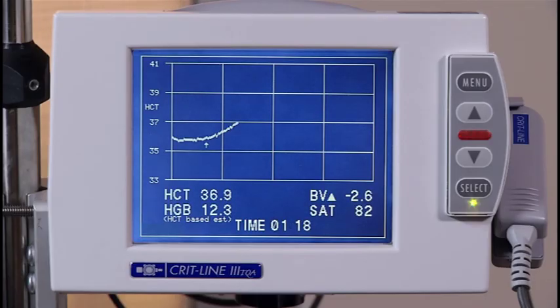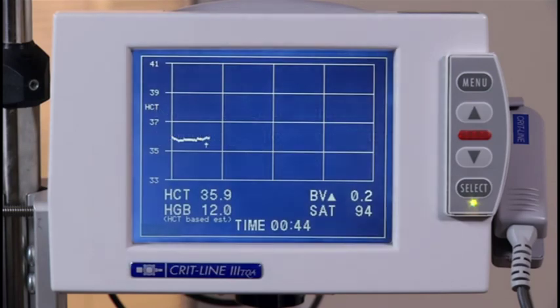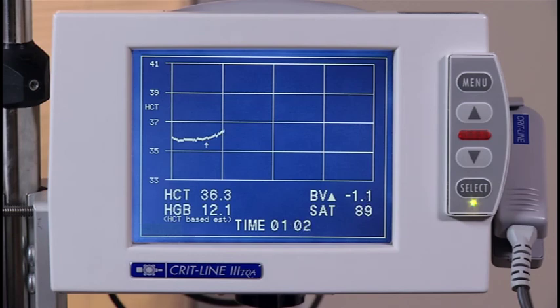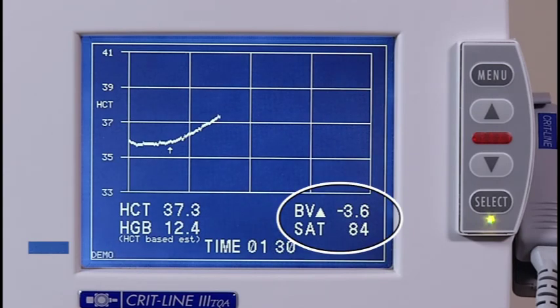Let's quickly review the hematocrit profile screen. This screen is the exact inverse of the blood volume profile screen — as fluid is ultrafiltrated from the patient, the hematocrit will increase proportionately. A dashed line will be displayed on the screen if a hematocrit limit was set. Now let's review the oxygen saturation profile screen. This screen is helpful when trying to determine at what point in a treatment a patient's oxygen saturation value dropped below an acceptable level. The normal range for arterial, fistula, or graft oxygen saturation is greater than 90 percent. The normal range for venous oxygen saturation is between 60 and 80 percent. If oxygen saturation drops too low, oxygen administration may be considered according to clinic policy. You do not have to be in the oxygen profile screen to know the oxygen saturation — the value is also displayed on the blood volume profile screen.